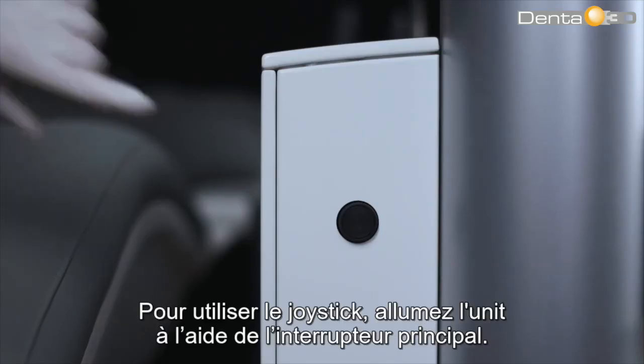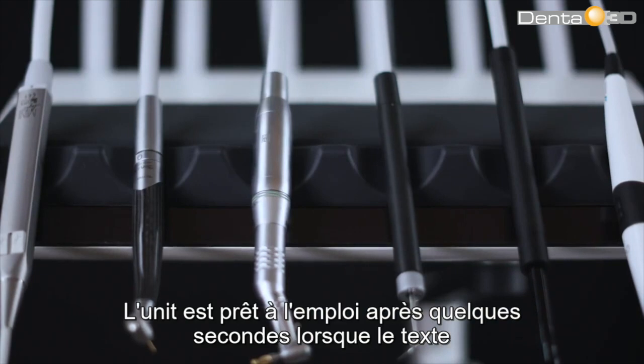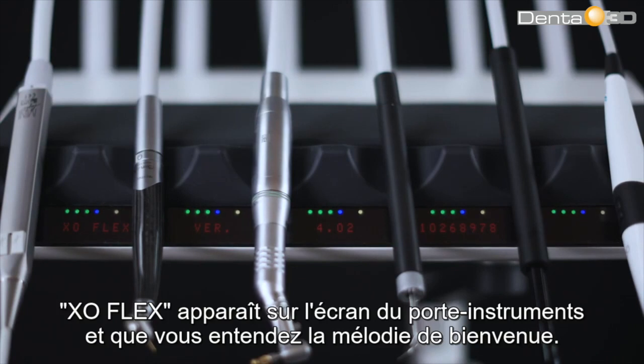To operate with the joystick, switch the unit on using the main switch. The unit is ready for use after a few seconds when the text XO Flex is shown on the instrument bridge display and you hear the welcome tune.